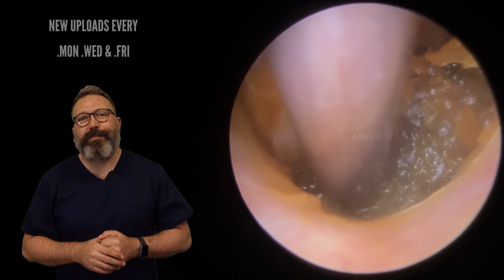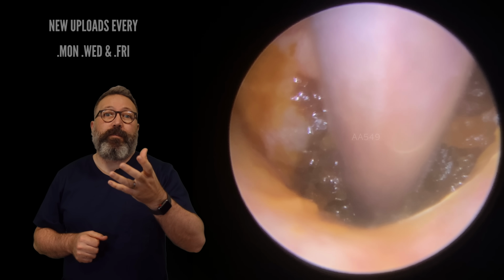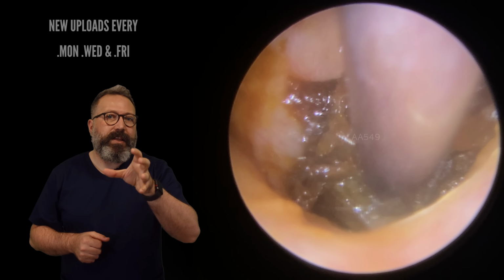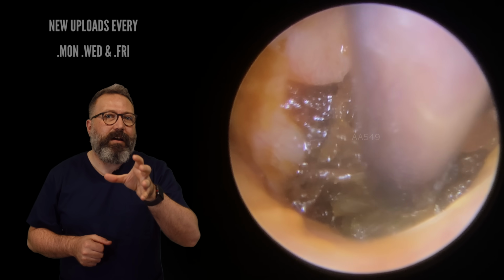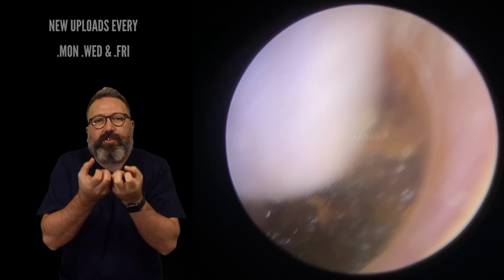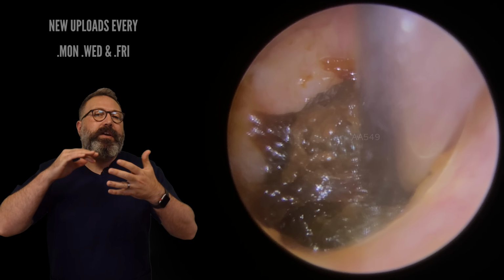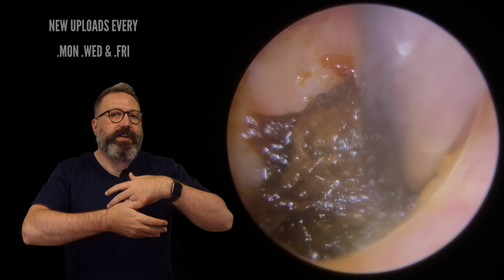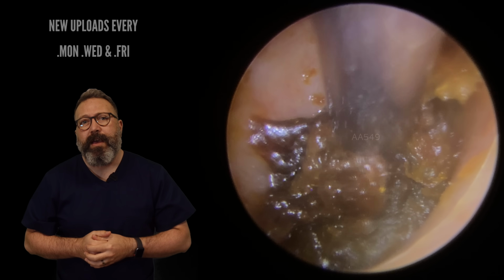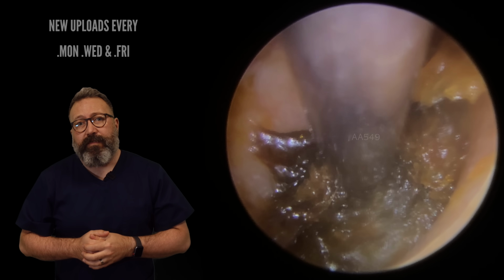Now if you watch the video on Friday, you'll have seen that we have this very, very soft and sticky type wax. Now, as we take that skin ribbon away, you'll start to see this section is very similar. We've got these slightly harder pieces in here, but behind that, the wax has become super soft. Now, I think what's happened is where the water's been going in from baths and showers, it's been kind of getting behind that first initial section and then sitting there and pooling and softening this wax up. But unfortunately, that means it's now stuck to the eardrum. So we've got to work really carefully here.